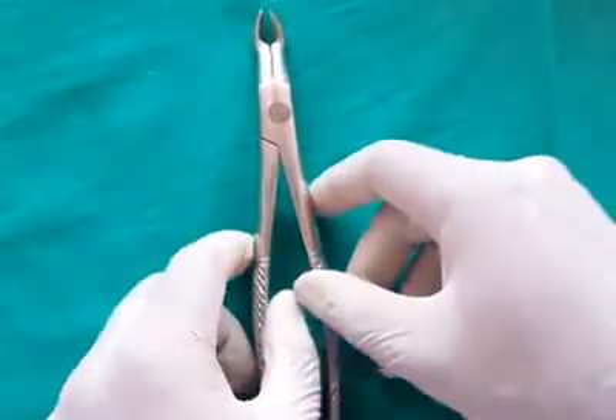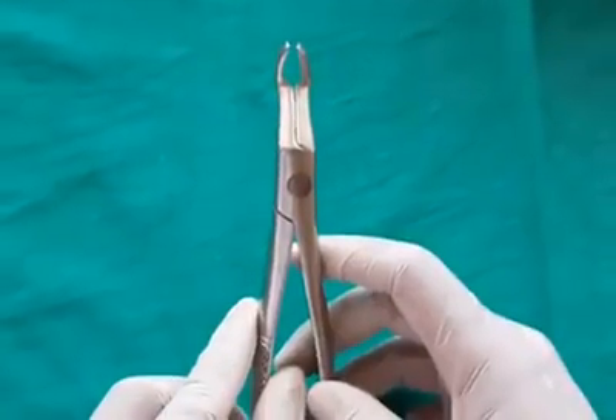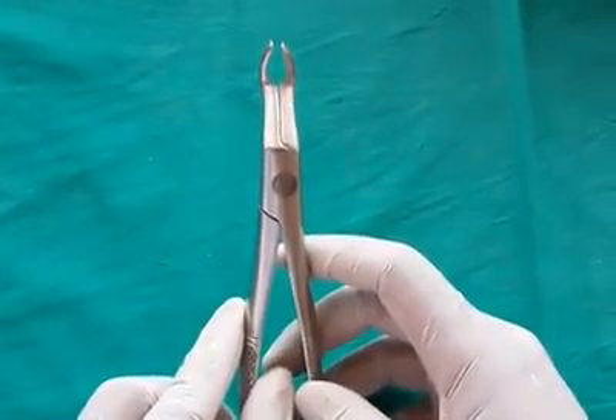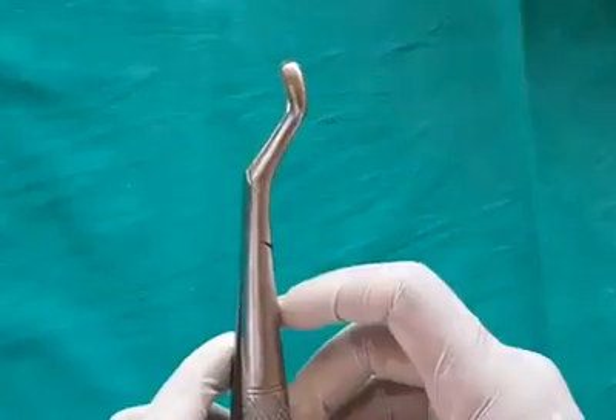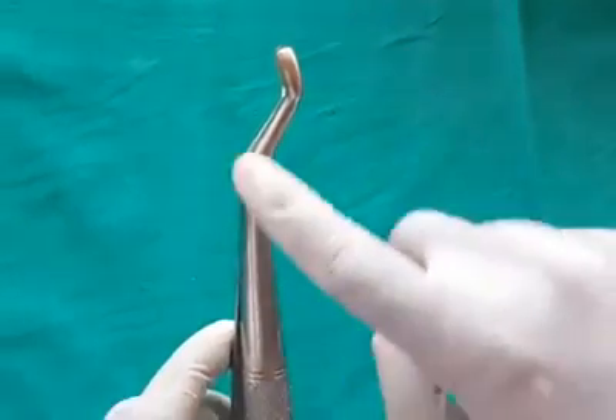Maxillary third molar forceps are designed keeping in mind that maxillary third molars often have fused and bulbous roots. The beaks are rounded, and the handle is sharply bent to facilitate better reach.